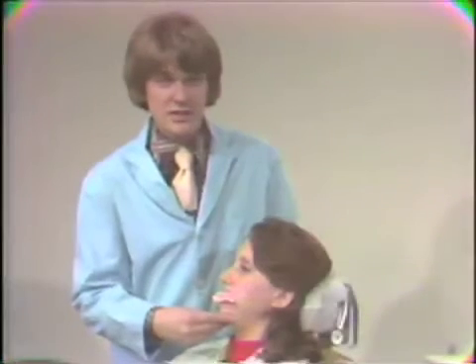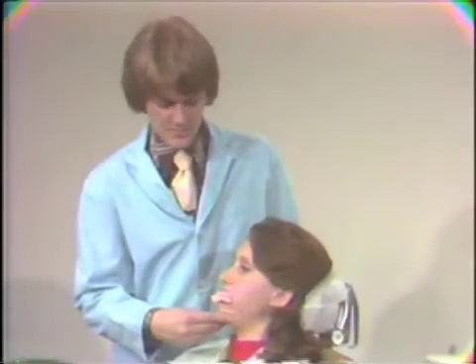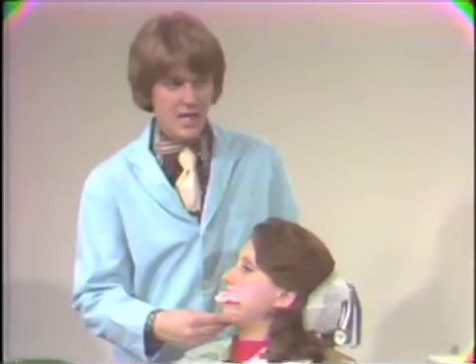Okay, now this is one of the potential problems of this system in relation to other systems that use the pantograph, for instance. You'll notice that the vision as far as what we can see is very limited. With the pantograph, you can easily visualize the fact that the patient is consistently going over the same border tracings. With this method, we can't. We're pretty much doing it blind.